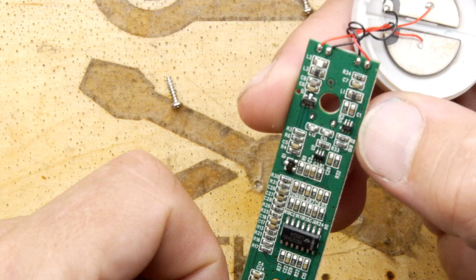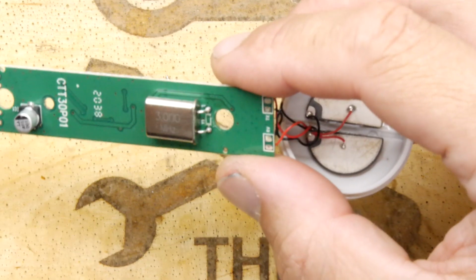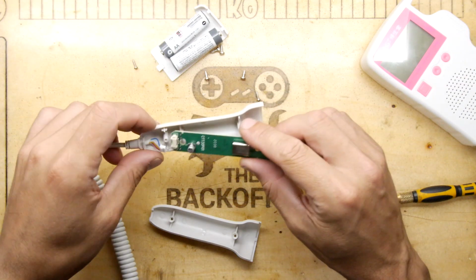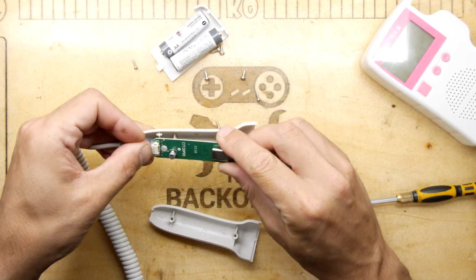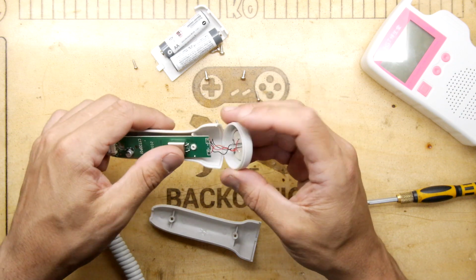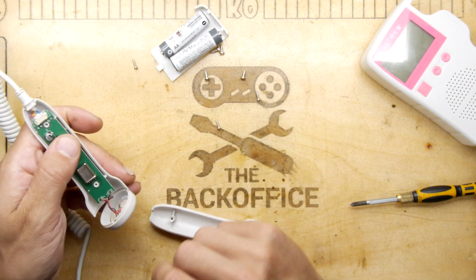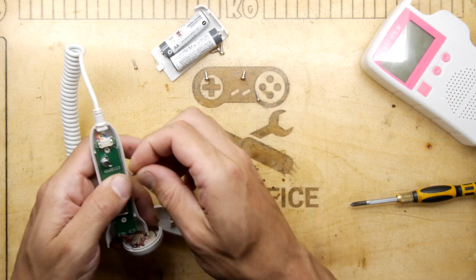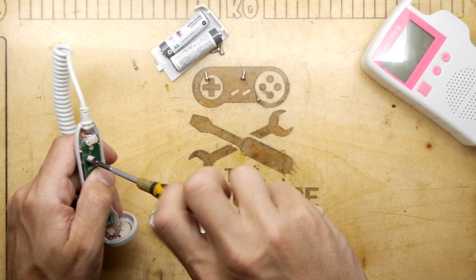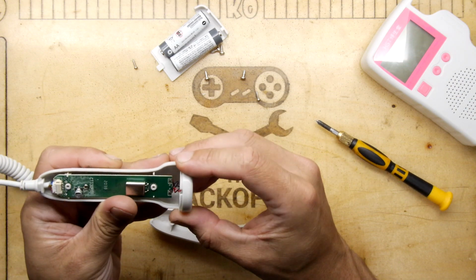But everything else is just regular passives, nothing too interesting. But yeah, put it all together and you've got something that can listen to a baby's heart. Now I do wonder though why it does misread the BPM. I did have a go at this on my kids, and I was absolutely shocked with the result because they came through so much louder. And I speculate that's down to there being a lot less chest meat on there, or perhaps they just have, you know, louder hearts. Could be that too. But yeah, they were sounding powerful.